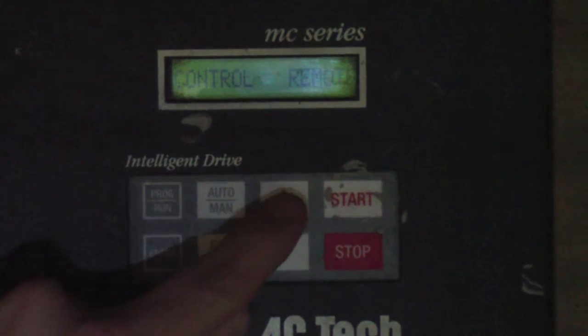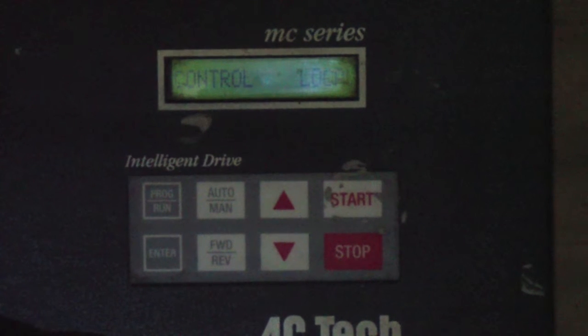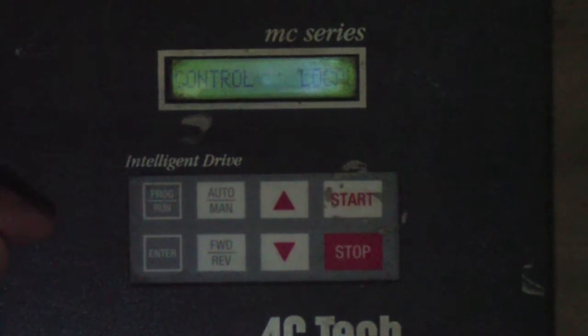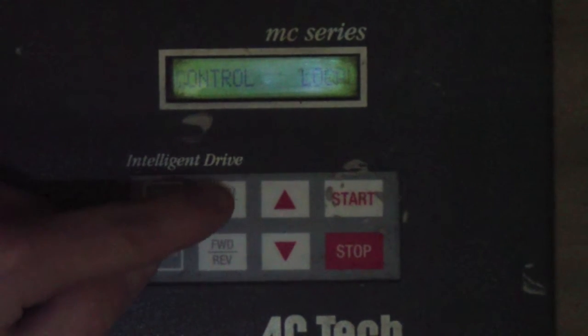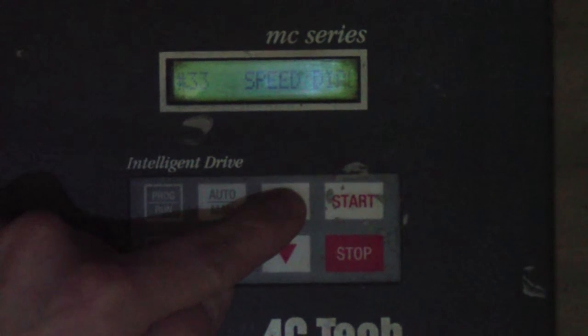The cursor will go over to the right-hand side. Hit the up arrow once and twice to change that to Control Local, then hit Enter. The cursor will go back to the left and we're now reading Control Local. Hit the Auto Man button again and use the up arrow to go to parameter number 57.